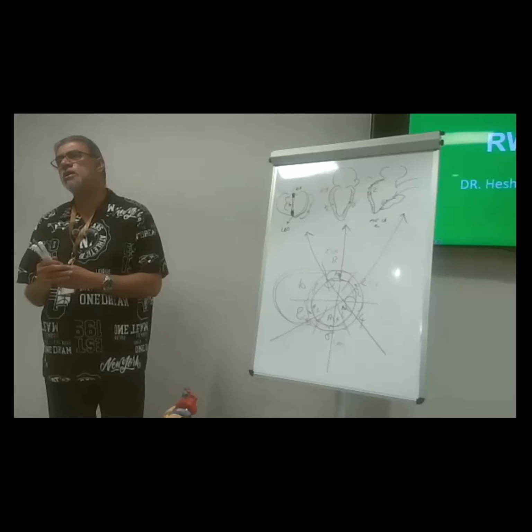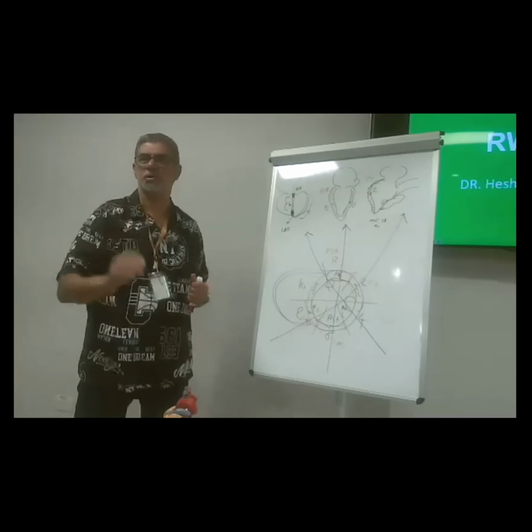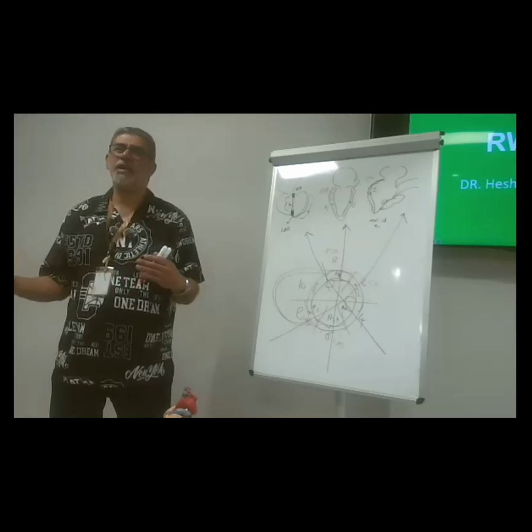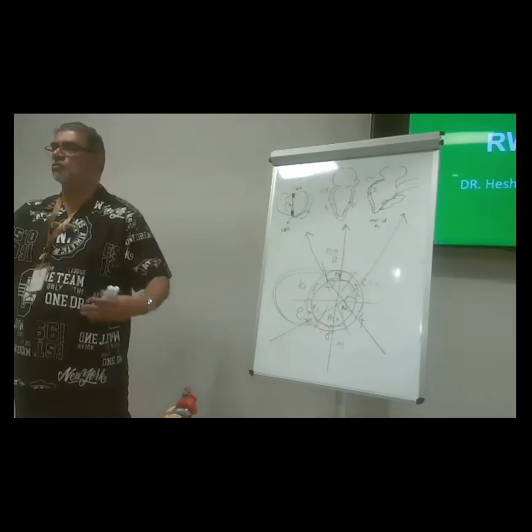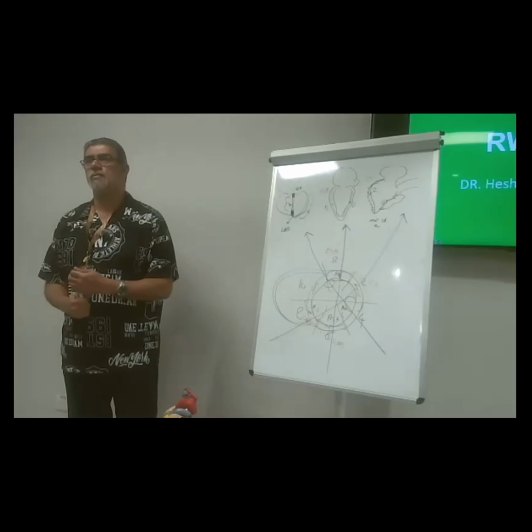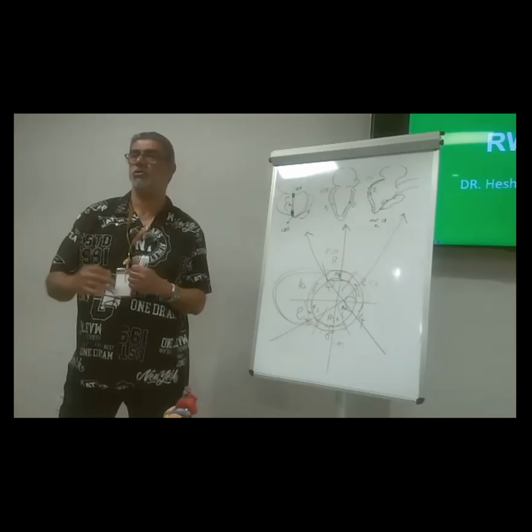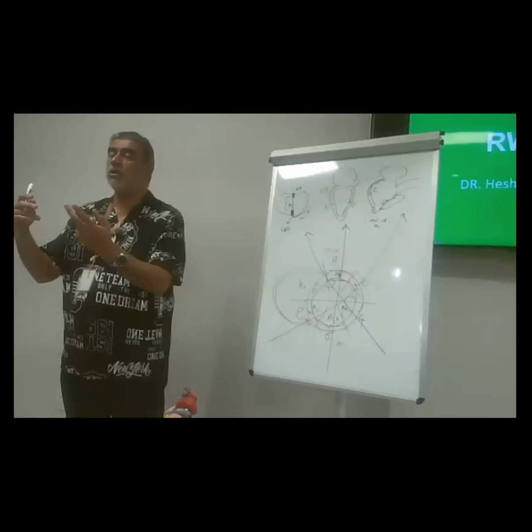How to differentiate normal from hypokinesia? Akinesia we can differentiate. It's not moving. But normal and hypokinesia, this is a dancing area. It's a gray zone. We need a specific thing to determine, is it hypokinetic or normal? Excellent. Thickening will be the determination for this, and there are only 2 tools to assess this.